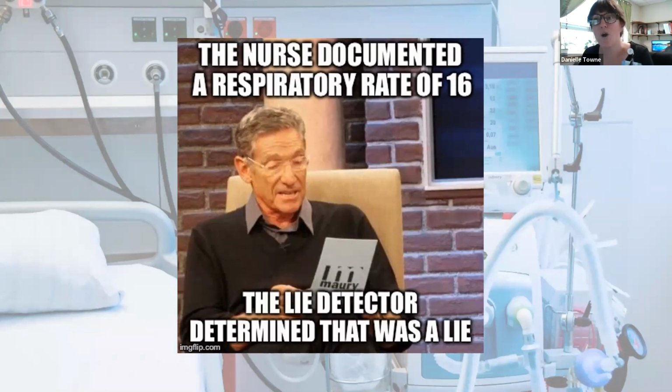Now, what happens when we breathe, when we exhale CO2, right? If we exhale a lot, we're blowing off a lot of CO2. And if we exhale a little, we're blowing off a little CO2. So if I take somebody that's breathing 40 times a minute and I cut that down to 16, I went from breathing a lot and blowing off a lot of CO2 to breathing a little and blowing off only a little CO2.